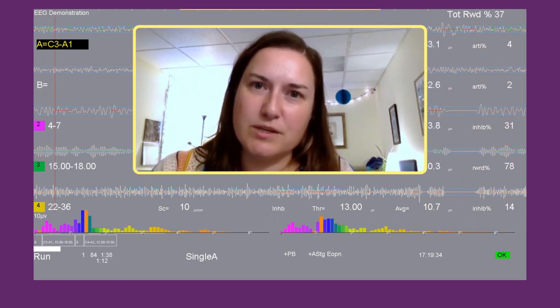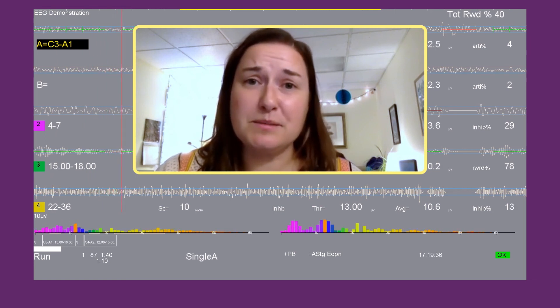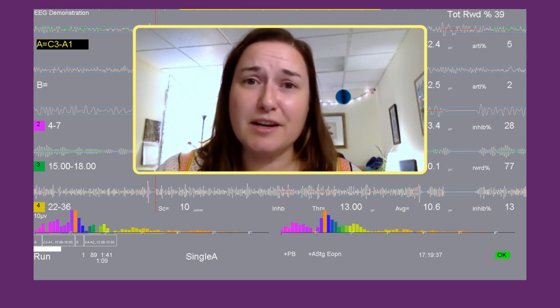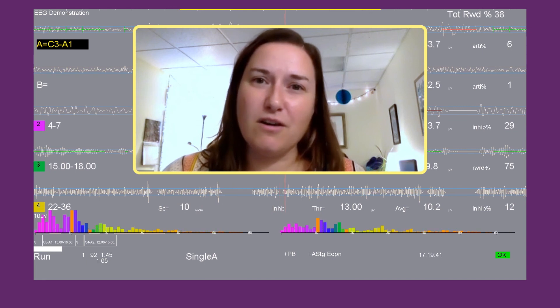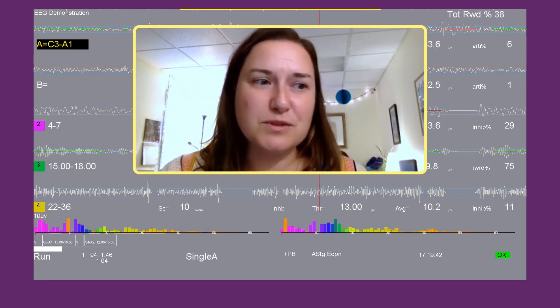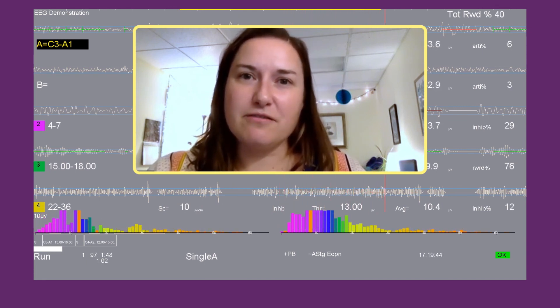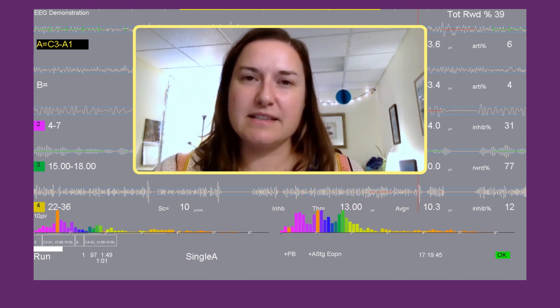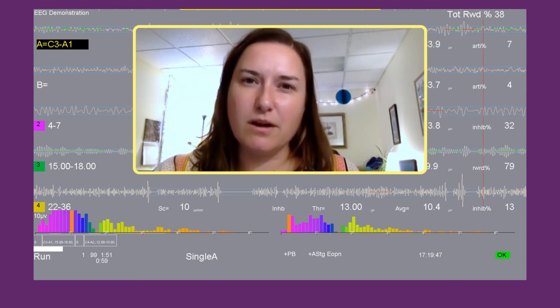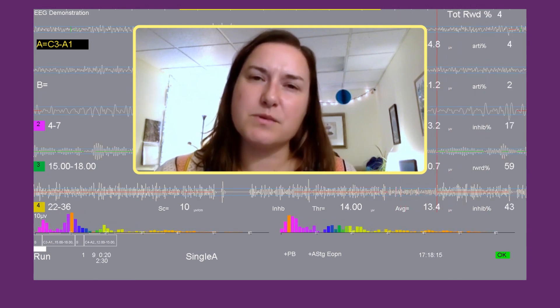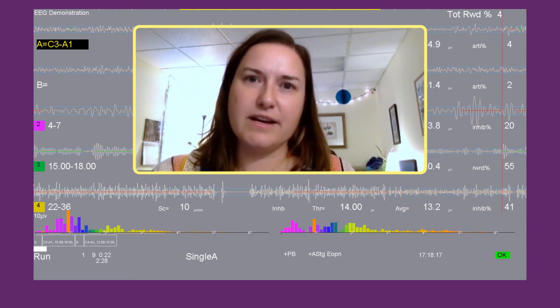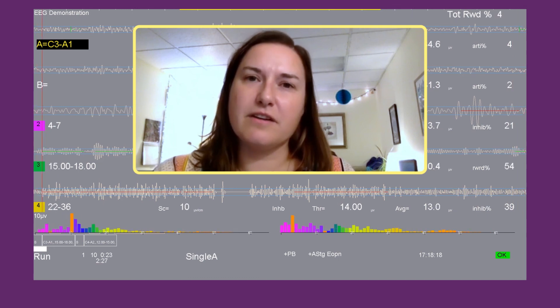I might adjust the frequency band to include 11 — so I might drop it from 12–15 to 11–14 — but I'm also going to be talking with the client about what is feeling good for them. It's kind of all a little bit exploratory, but using that spectral as a guidepost to let you know maybe this is where I could start the training and figure out from there what the client needs.